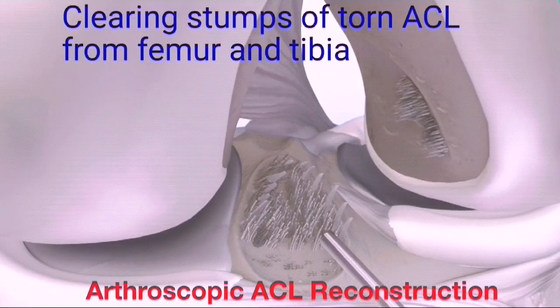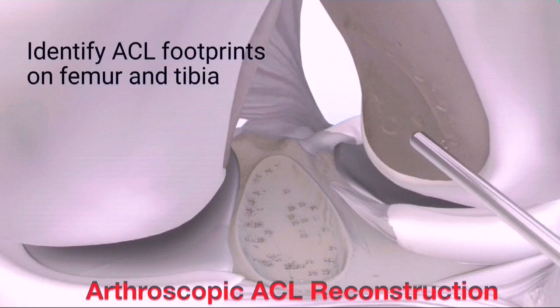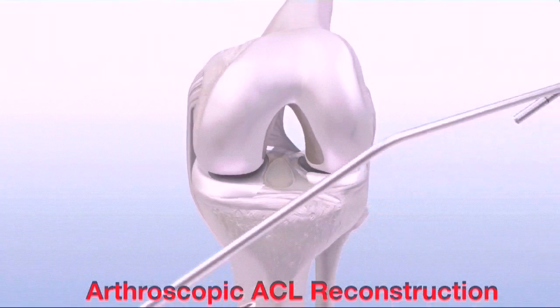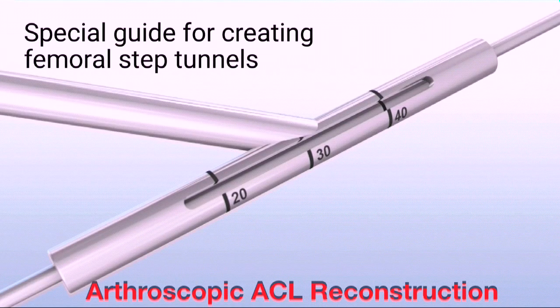Remove unwanted remnant ACL tissue and mark the center of the desired tunnel locations. Then insert the GraftMax curved guide into the anteromedial portal with the knee flexed at 90 degrees. Insert the GraftMax indicator pin into the sleeve and down to bone to assess the projected guide pin exit and femoral aperture to cortex, or AC, length.